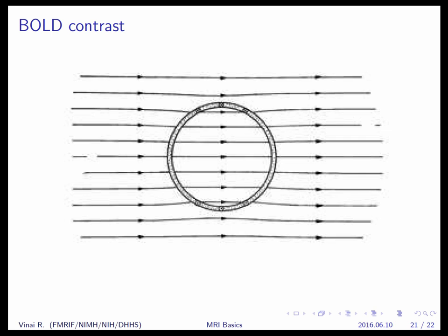Sorry? I'm not sure, but I think the T2 and T1 would be similar. In the vessel and in the background, the T2 and T1 would be similar as compared to the earlier case. T1 not so different, but the T2, T2 star, that's the effect that we're actually measuring here.